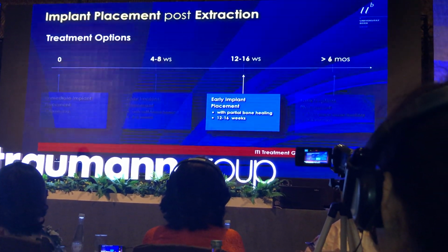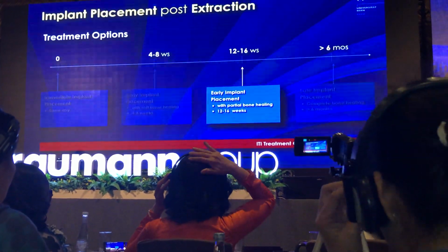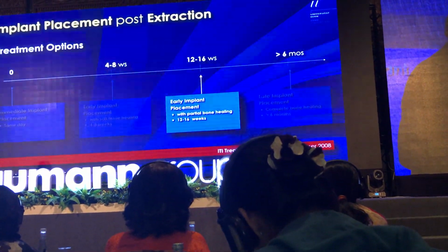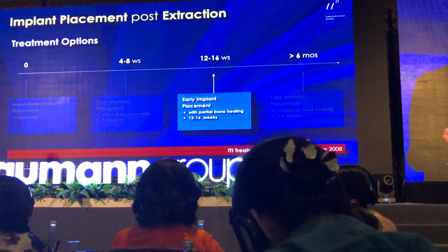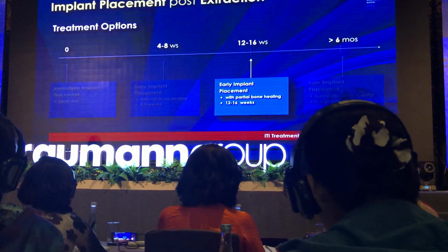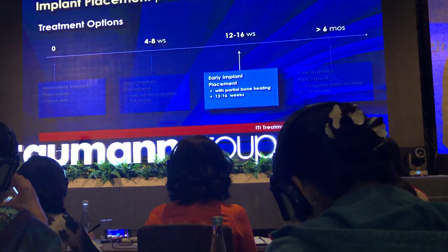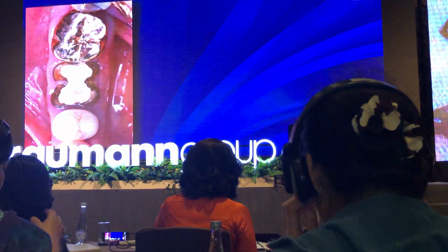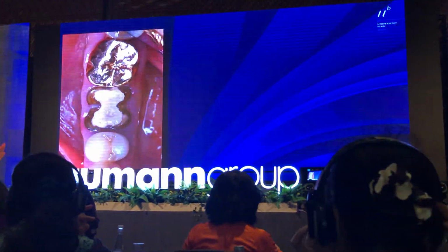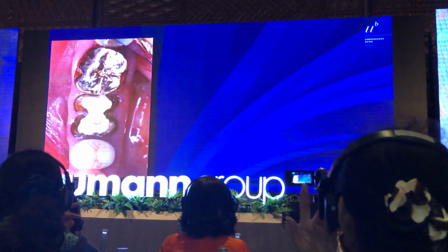Okay, now sometimes we want to wait 4 months, and as I said, this is done on purpose. And sometimes you get patients where the extraction has already taken place, and when you get the patient, 4 months have already passed, then you cannot influence that. So this would be a case where you do that on purpose. And also that's a case from more than, I think, 2004.